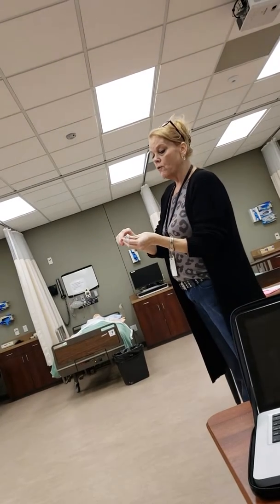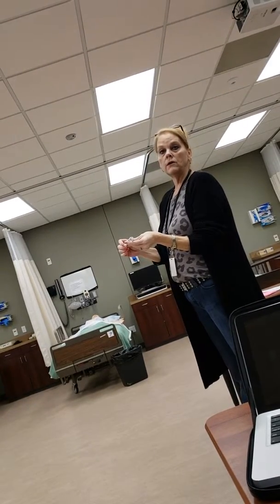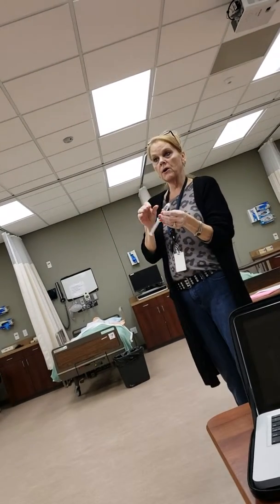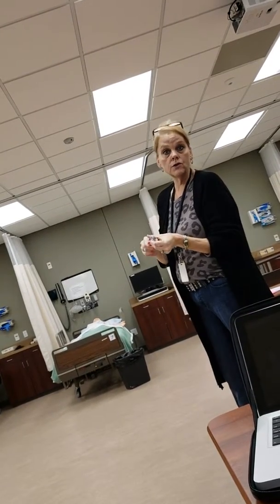Your medication, 4 seconds. So you look at your graduations, you've got it attached, and you just go 1 line, 2, 3, 4, 2 lines, 2, 3, 4, 3 lines. So essentially, when you're pushing the medication, it's a start and stop. You're not doing a continuous flow. You don't necessarily have to watch your watch, because if you did your math correctly, it should take you that allotted time to be finished with it. So again, you'll just go 1 line, 2, 3, 4, 2 lines.